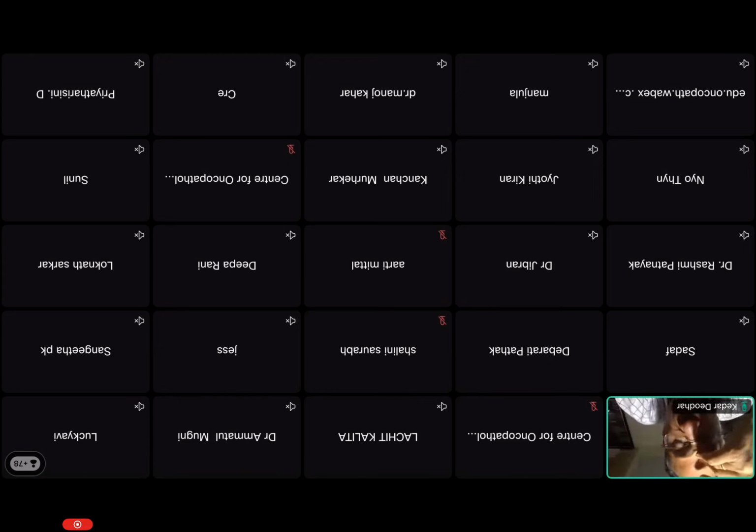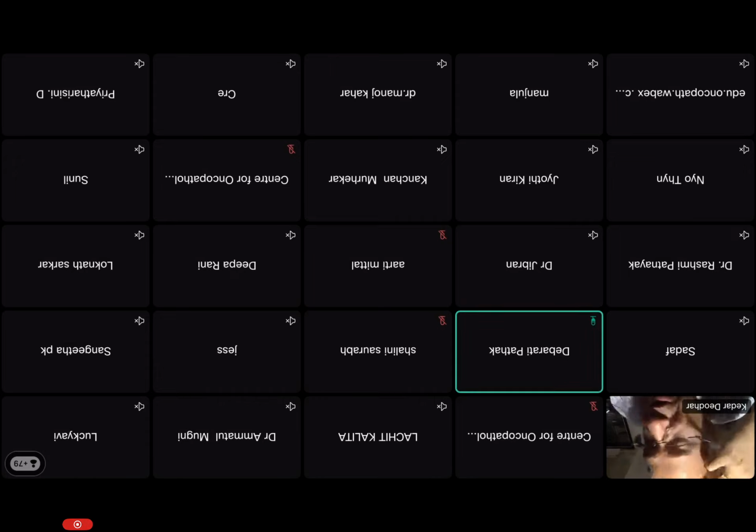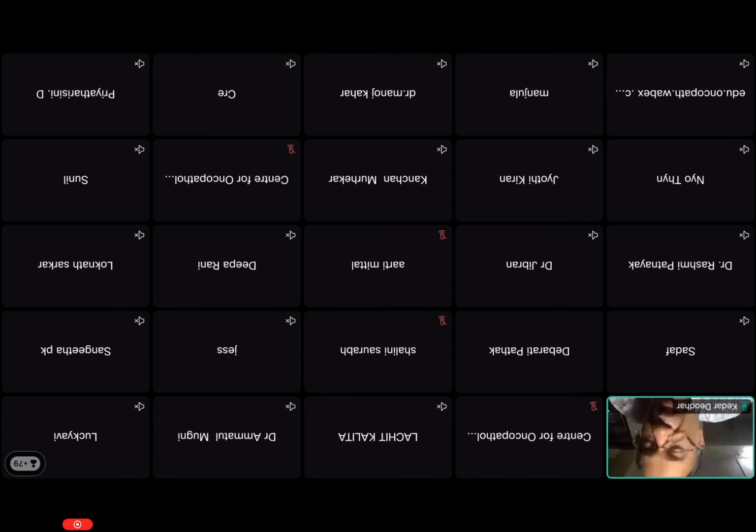Okay, sir. Will PAS help in detecting scant signet ring cell deposits in the omentum? PAS stain we don't use for the omentum. So are you looking for metastatic adenocarcinoma in the omentum which is resected along with the stomach, or are you looking at a biopsy? Along with the resected stomach. PAS is useful, but if you are really worried about a metastatic focus, first I will look for a fibrotic reaction around the particular area where you suspect a group of metastatic cells. If you have the facility, it's better to use immunohistochemistry to delineate epithelial cells. There's a technical possibility that you have mucin and then PAS may be positive. So fibrous reaction and immunohistochemistry with cytokeratin are better for looking for metastasis in the omentum. Okay, sir.